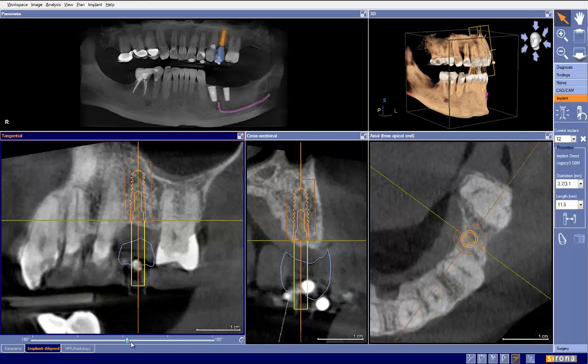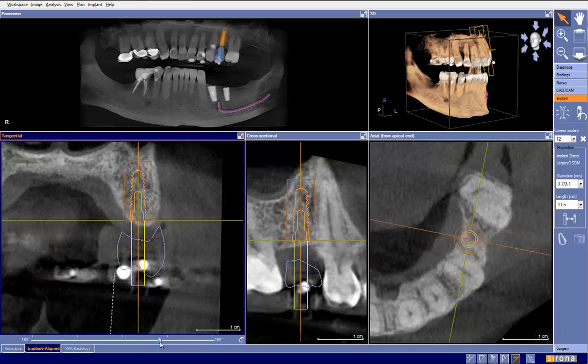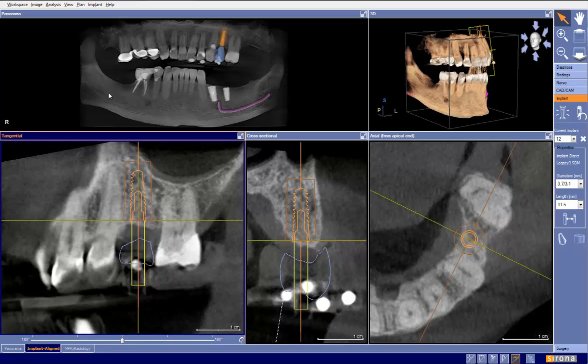So the last things that we'll check are our 360 view here, moving our slider, watching our implant, making sure that we're not to the sinus right here, not too close to this adjacent root, which we're not, and there we go. So again, this is a wonderful example on tooth number 12 here of the difference between the planning that we learned that we were doing before and the planning that we learned this weekend, and how, one, making sure that even with or without CEREC data we can get this better, and what to recognize moving forward.